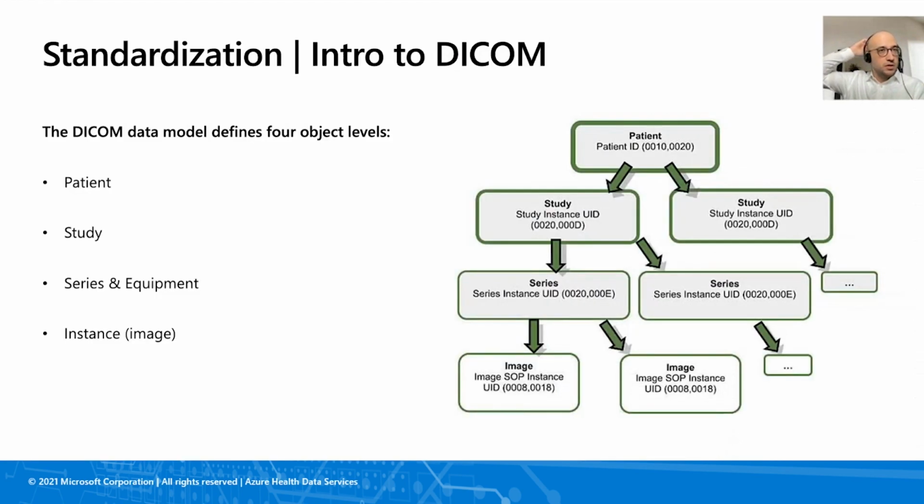And as we are familiar with the DICOM object, I also would like to make sure that we are aware of the DICOM data model levels that we can see.